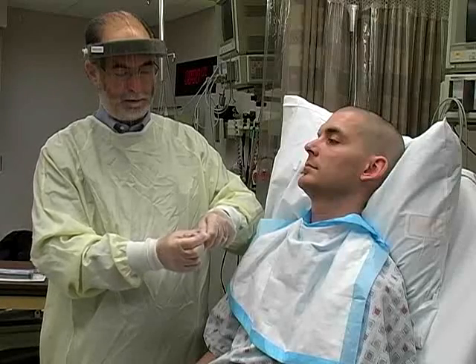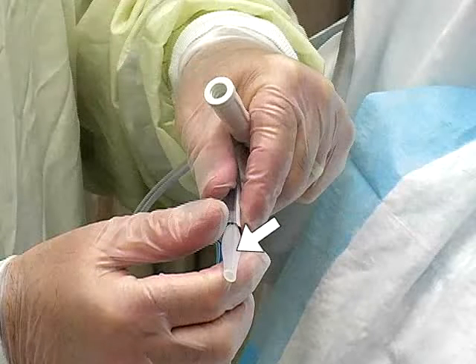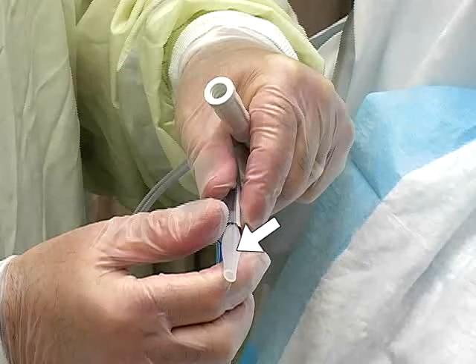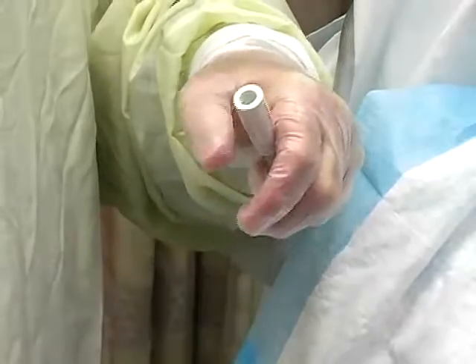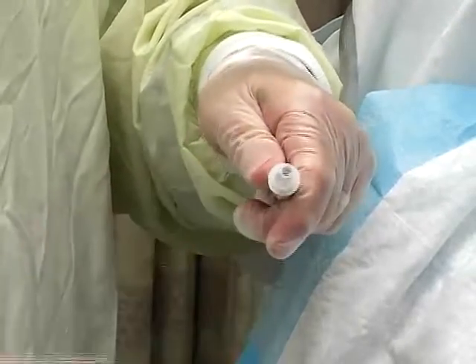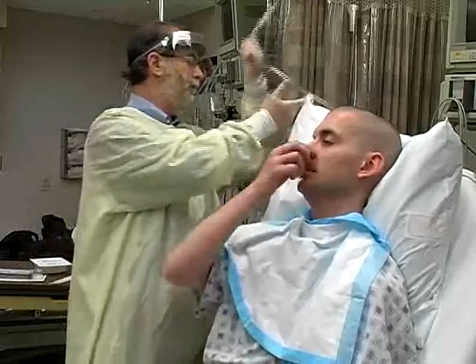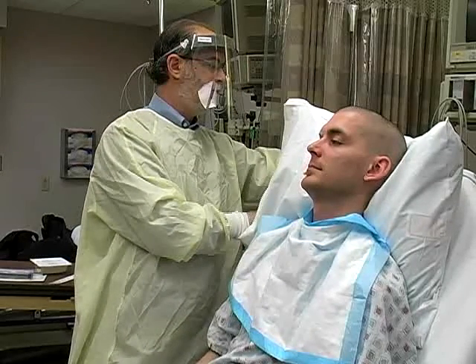Next, prepare the nasogastric tube. The suction adapter supplied with the tube is often misplaced during preparation and tube placement, so it is beneficial to remove it from the nasogastric tube and insert it into the suction tubing prior to the procedure. Place the suction tubing behind the patient's pillow so that it is within easy reach once the tube has been inserted.